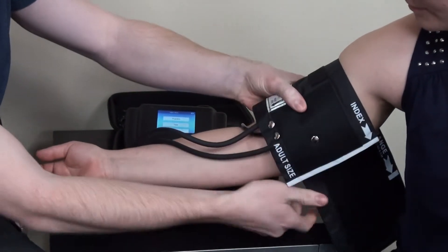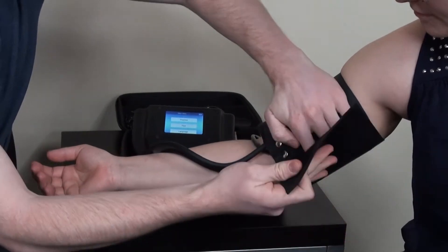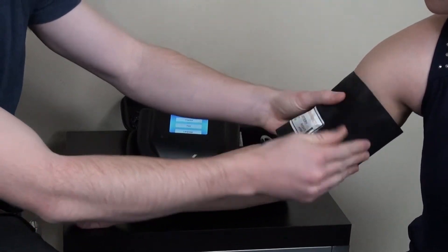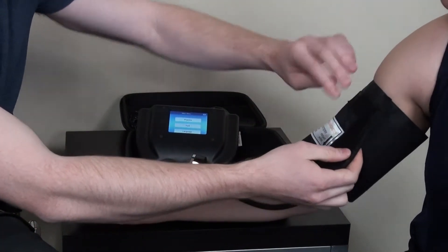This cuff can be used on a student, mannequin, or the standard patient in a healthcare simulation setting.